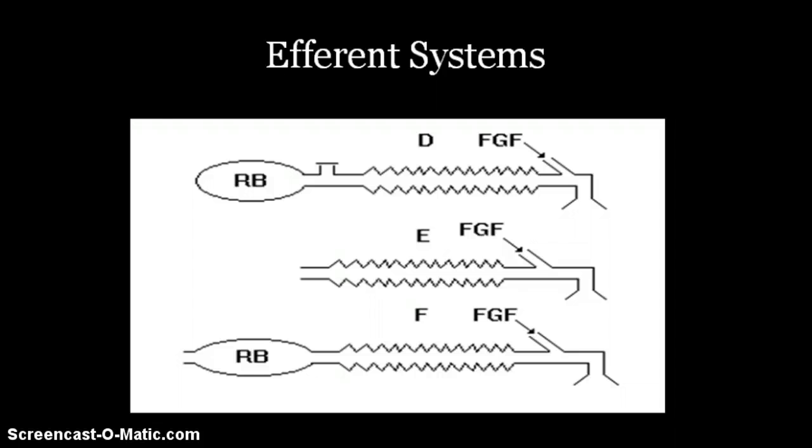In order to reduce fresh gas flow requirements, efferent systems are constructed with reservoirs in the efferent limb. With similar functioning, these systems are efficient and economical for controlled ventilation if there is a separation between fresh gas entry and the expiratory valve of a volume equaling at least one tidal volume of the patient. They are not economical during spontaneous breathing.